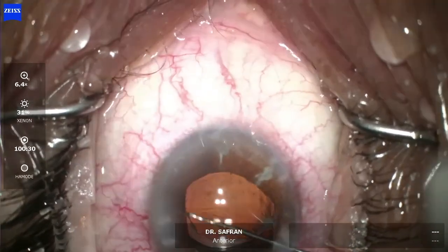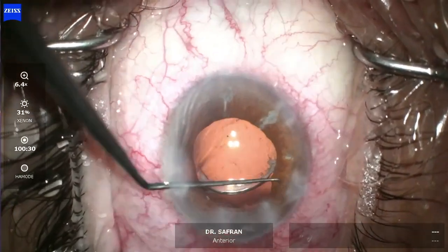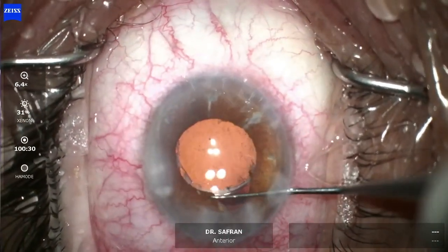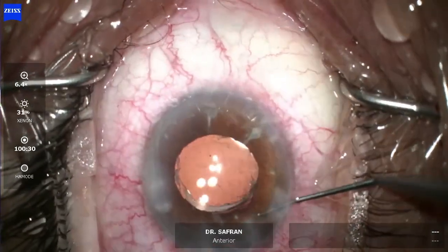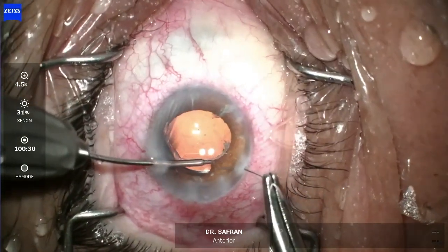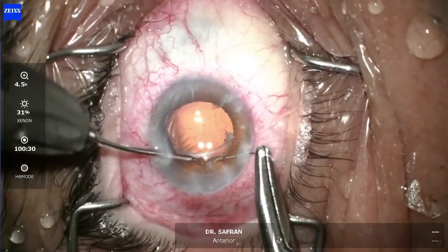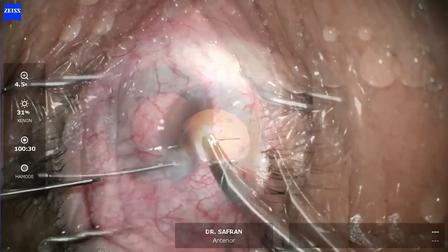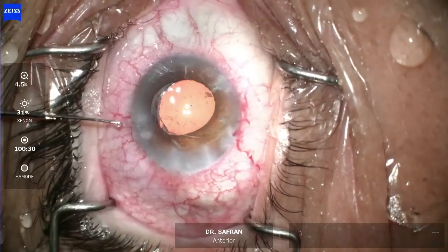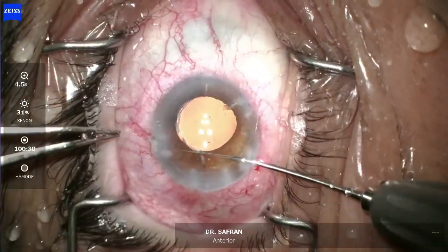I'm going to stroke the pupil with a Sinski hook to see if I can bring it down and get an idea of how to repair this atonic pupil to reduce glare for this patient. The pupil doesn't come down as much as I'd like, but I know there's a defect in this temporal iris. So I'm going to do a hemi-cerclage suture in this area using a CTC6 needle and 10-0 prolene, doing about five bites of the iris. I pull the needle out through a paracentesis, loop the other end out, do four throws to create a square knot, pull the knot into the eye and tighten it.